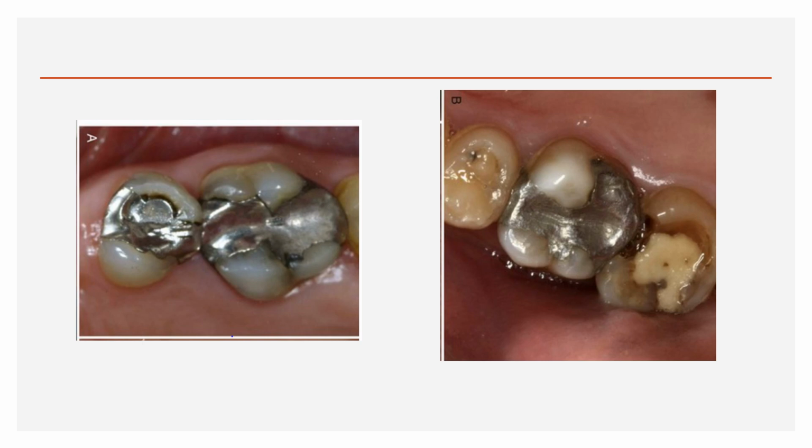Secondly, about contouring: when you are doing a restoration, you should at least try to replicate the lost cusp according to the occlusion. In the amalgam you can clearly see the palatal surface is not contoured properly, and you can see bite marks there. So contouring is also an important part. Ideally, this restoration has to be removed and replaced with a new one. Especially you can see the secondary caries with the composite on the right side of the picture.